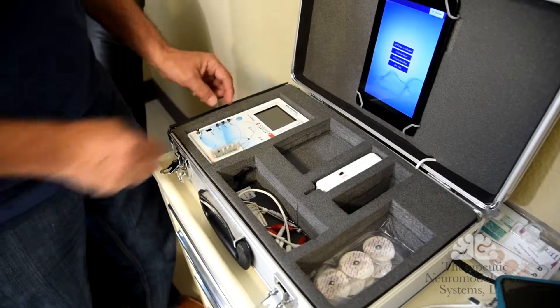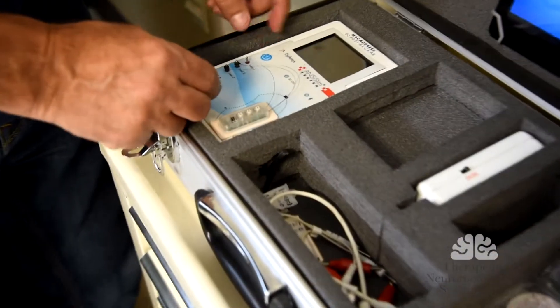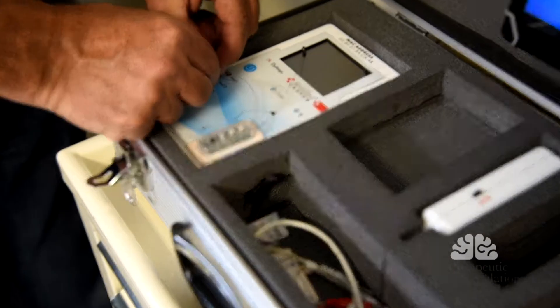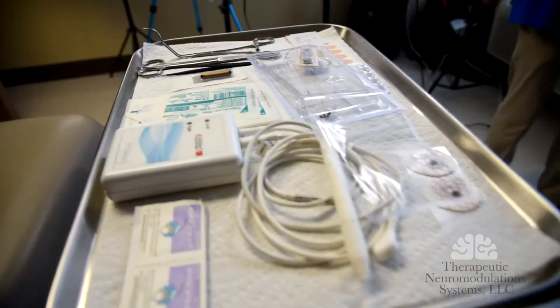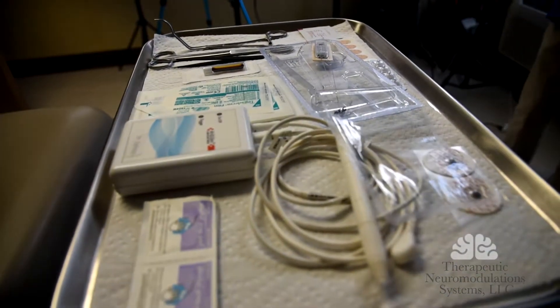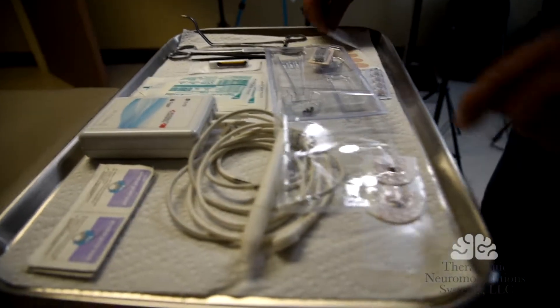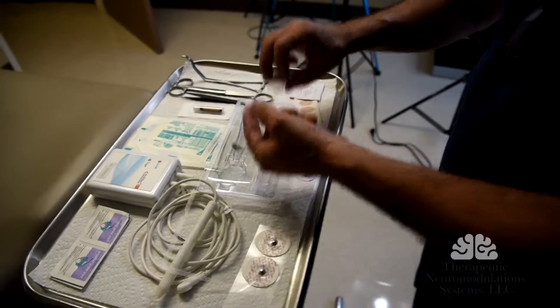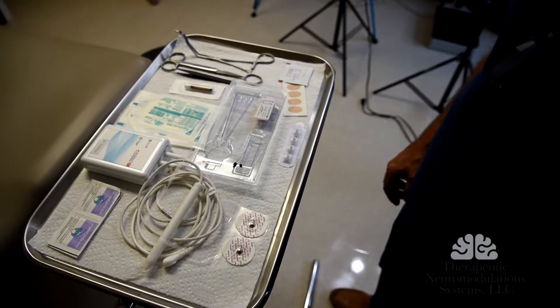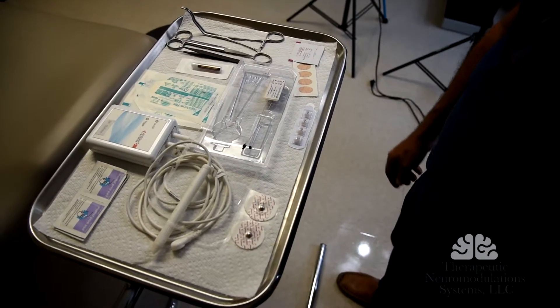So we're going to shut this down because this is ready to go. We're going to unhook and disconnect all the lines because the device is programmed. We're going to bring the device to the table. So we're going to stop at that point — this is the programming of the device and the device is ready. So now let's get the patient prepped and put the device on.